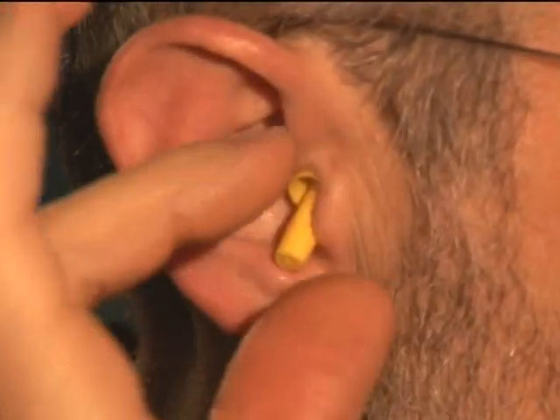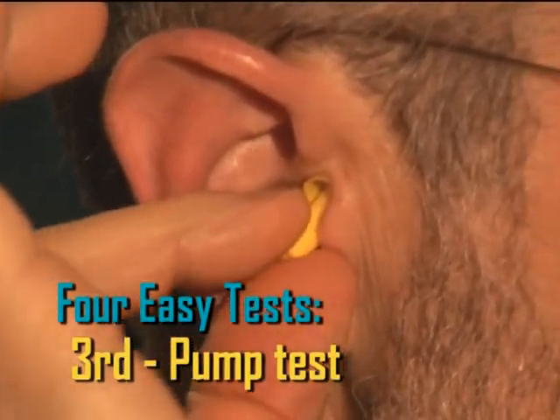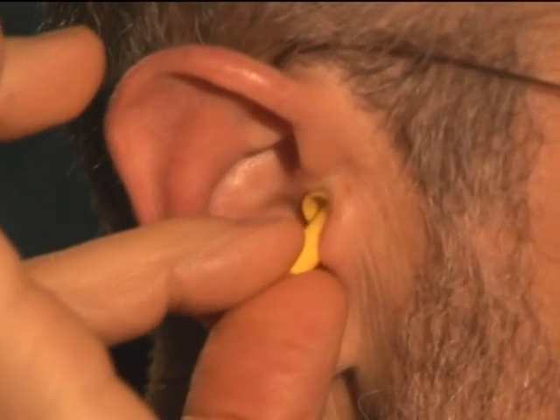The pump test is similar. Take the stem of the plug and gently pump it in and out of your ear canal. On the in stroke, you are compressing the trapped air, and on the outstroke, you are releasing the pressure. This compression and release will push and pull on the eardrum, moving it back and forth. You will feel this as though you were going up and down in an elevator or ascending and descending in an airplane. If all you feel during the pumping is a sense of touch in your ear canal and you don't feel any of this pressure change, then the plug is not properly sealed.